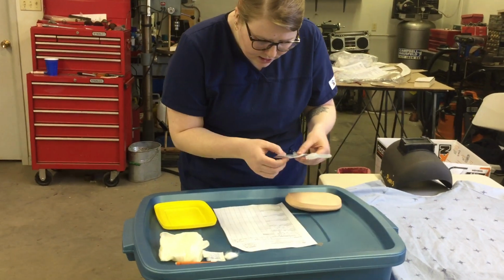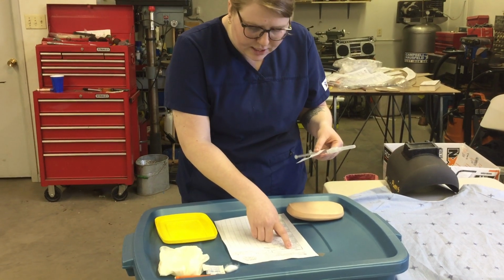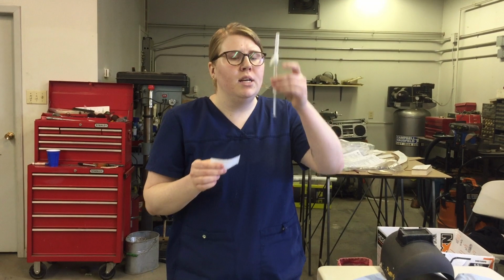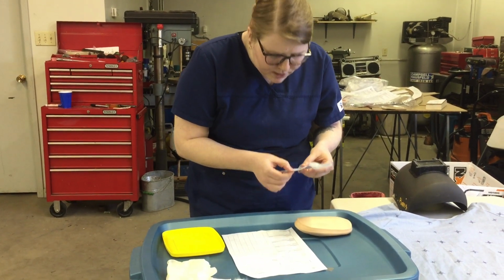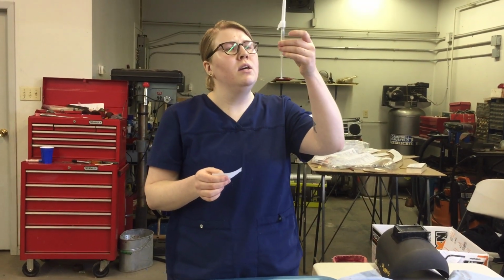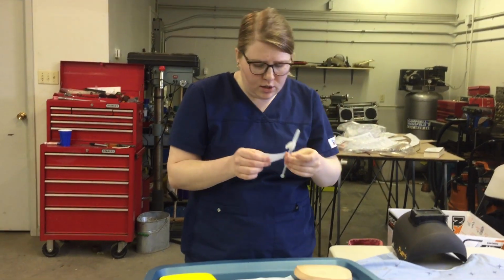So we have Jake Nursing, right patient, date of birth January 1st, 1960. He has no known allergies, so that is good. So we have dimenhydrinate, and this is dimenhydrinate in here, so that's the right drug. We have 150 milligrams, so it's 50 milligrams per ml, so we have 3 mLs to give us 150. So this is 3 mLs with no bubbles, so that's the correct dose.